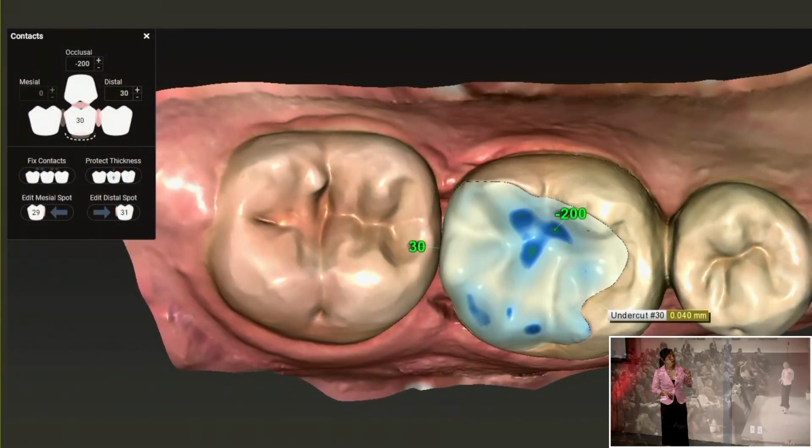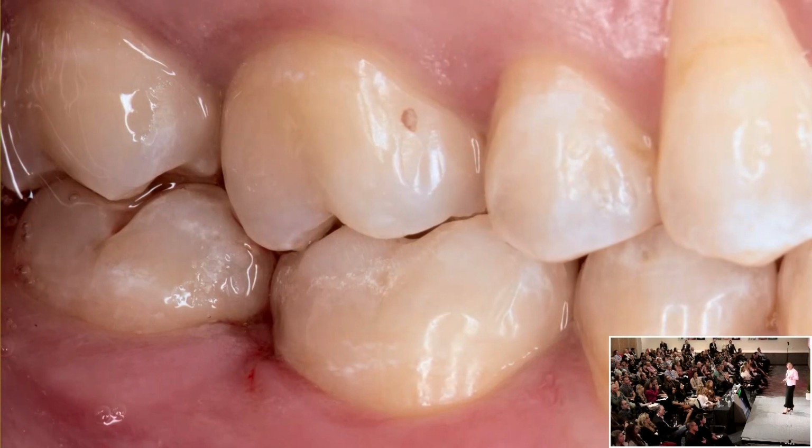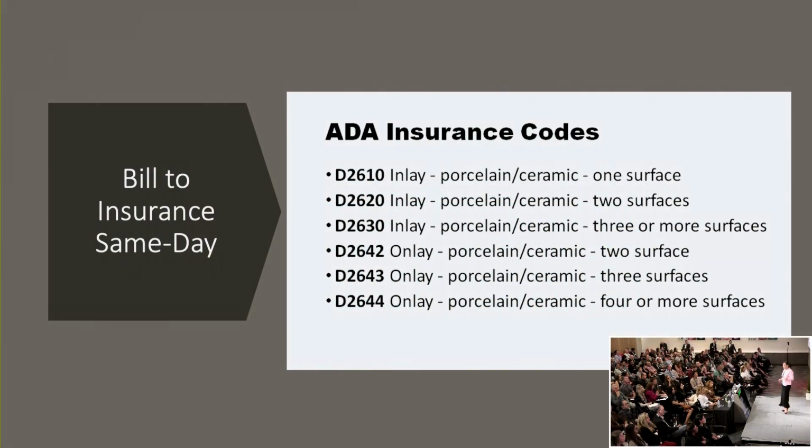And I use the artificial restorative intelligence that's built into our software to do a proposal that took one click. I didn't have to do much to it. I think I just closed up the contact a little bit more on the distal lingual. And here's his restoration on number 30. We tried to take a good final picture on him, but he really did not want to stay. He wanted to leave. He did not want to come back. So this was his final, and he was very happy, and we were able to take care of him that same day.